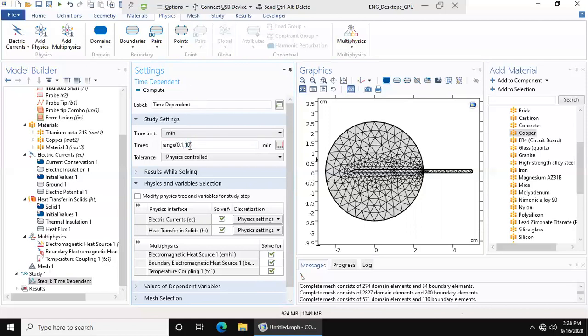You can make it go for as long as you want, but beware. If I made this 1,000 minutes, that computing time is going to take a very long time. And depending on your computer, especially in my situation, because I am projecting the school's computer onto my laptop, it could crash your system if it takes too much RAM or time.